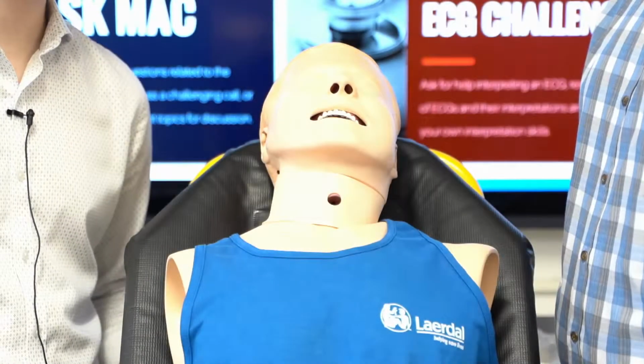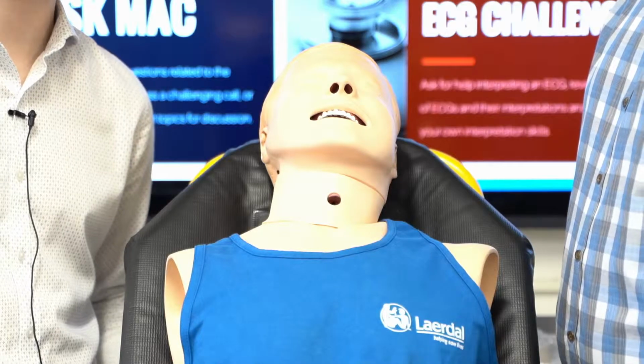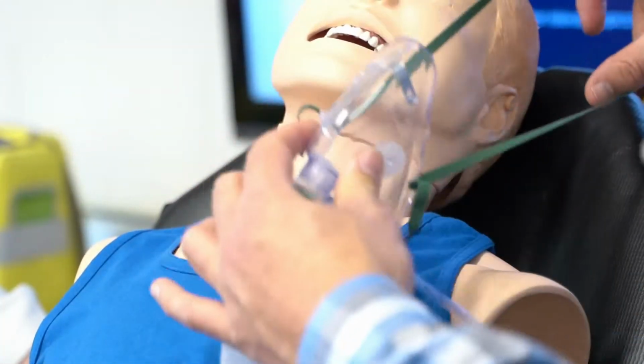Okay, so remember with the laryngectomy patient that's well established, there most likely will not be a tube in place. That's fine. There's no connection between the oral pharynx and the trachea itself. So we're just going to oxygenate via the stoma.